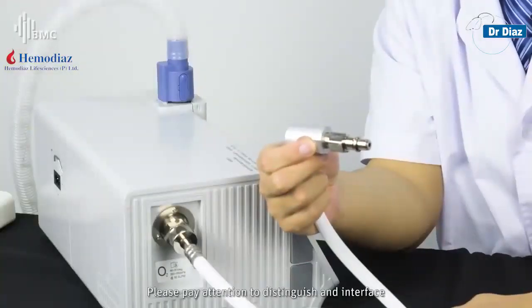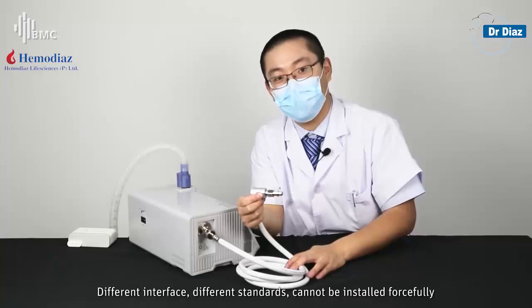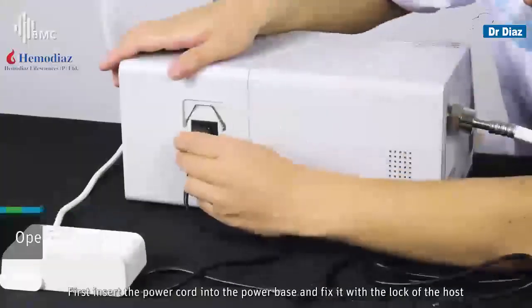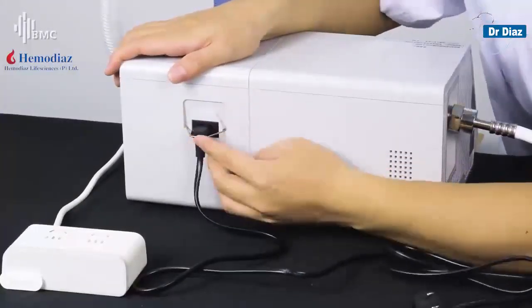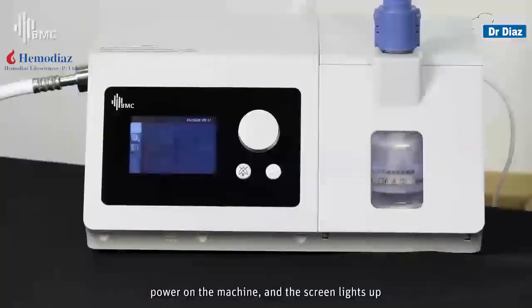Please pay attention to distinguishing the interface — different standards cannot be installed forcefully. First, insert the power cord into the power base and fix it with the lock of the host. Power on the machine and the screen lights up.